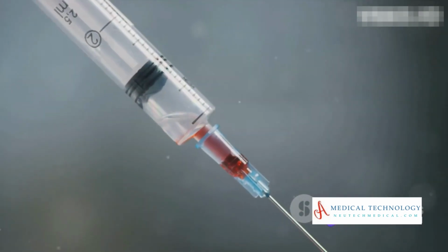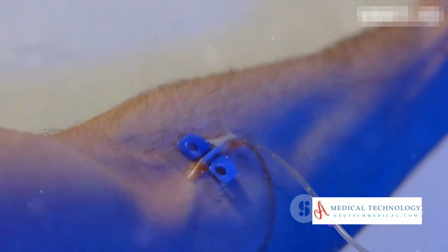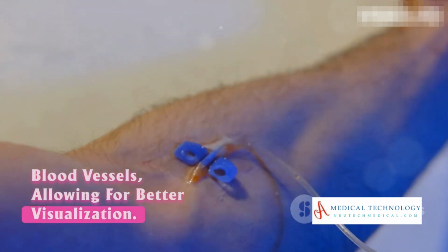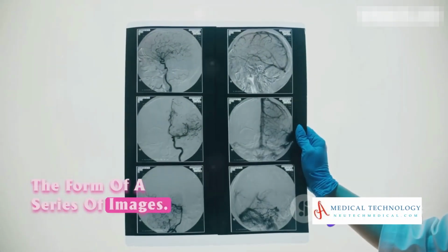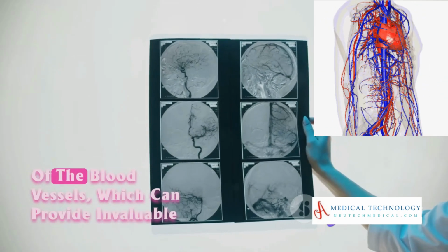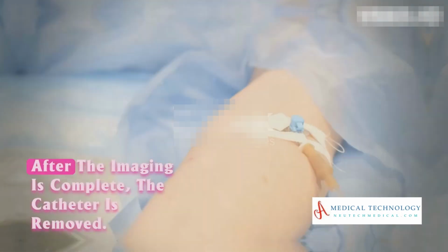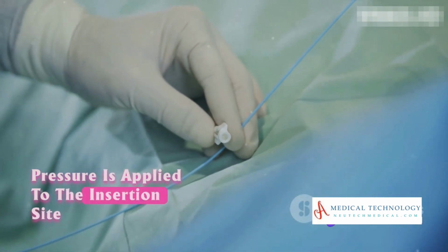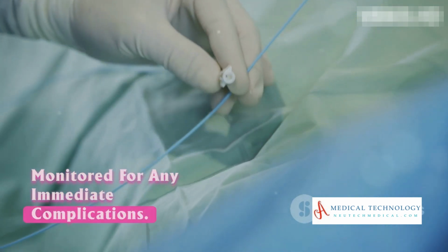Once the catheter is in place, the contrast dye is injected. X-ray images are then taken as the dye travels through the blood vessels. This contrast dye helps to highlight the blood vessels, allowing for better visualization. The X-ray imaging can be continuous or take the form of a series of images. The goal is to create a detailed map of the blood vessels, which can provide invaluable information for diagnosis and treatment planning. After the imaging is complete, the catheter is removed. Pressure is applied to the insertion site to prevent bleeding, and the patient is monitored for any immediate complications.